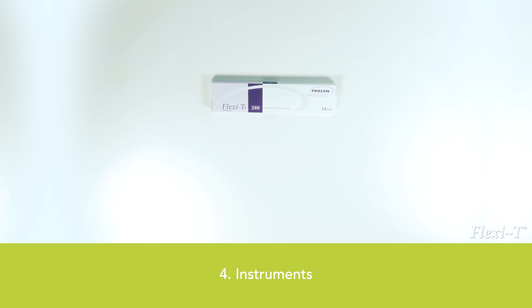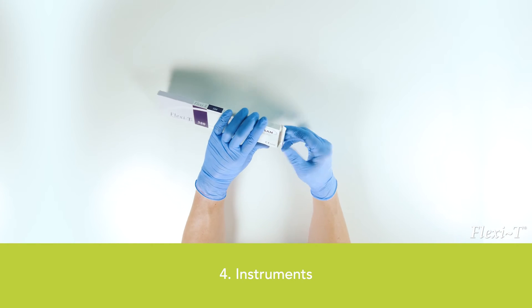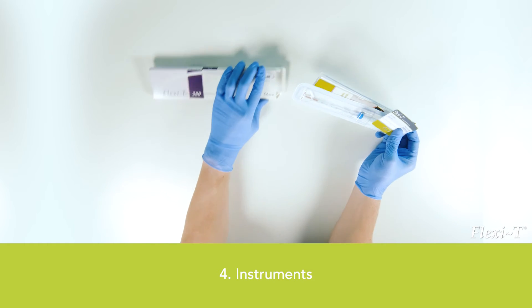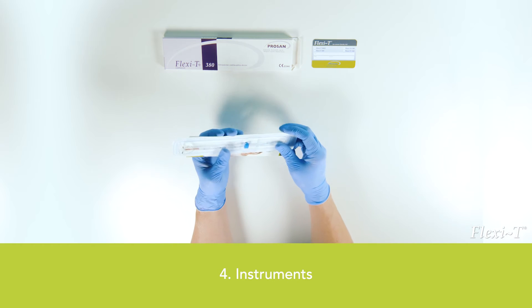Remove the Flexi-T IUD, the IFU, the IFW, and the card for the patient from the packaging, and read the instruction for use carefully. Do not yet open the sterile packaging with the Flexi-T inside.